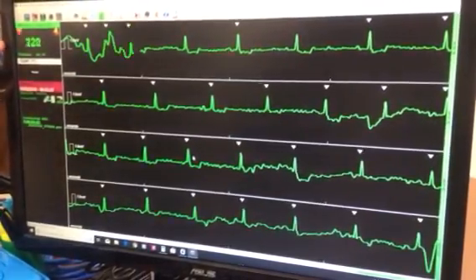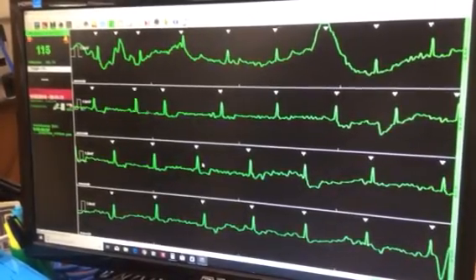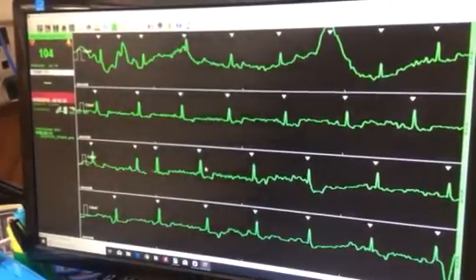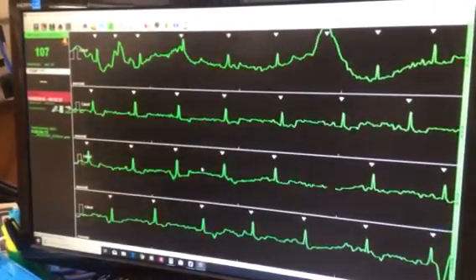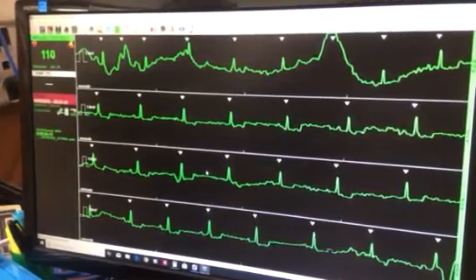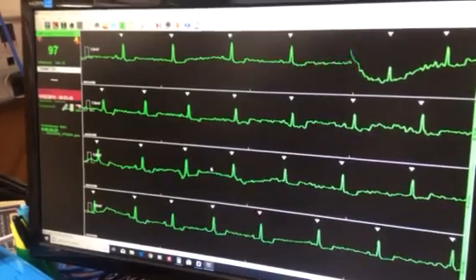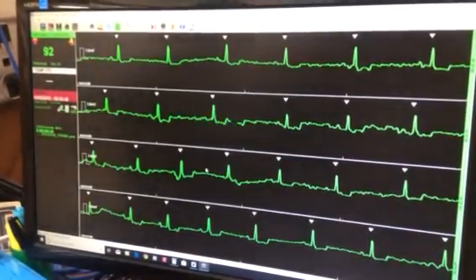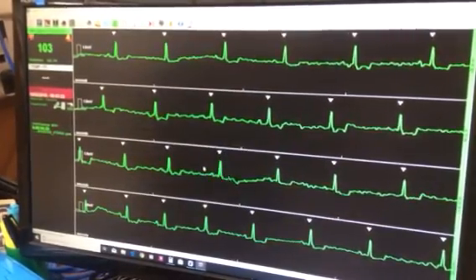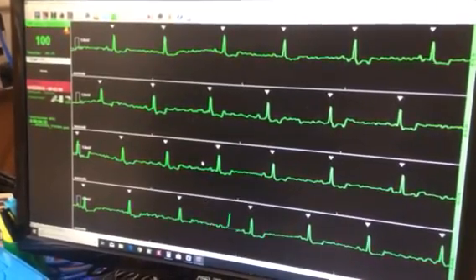Okay, so that's the heart rate, and that shows pretty good normal. Yeah, that's pretty good.